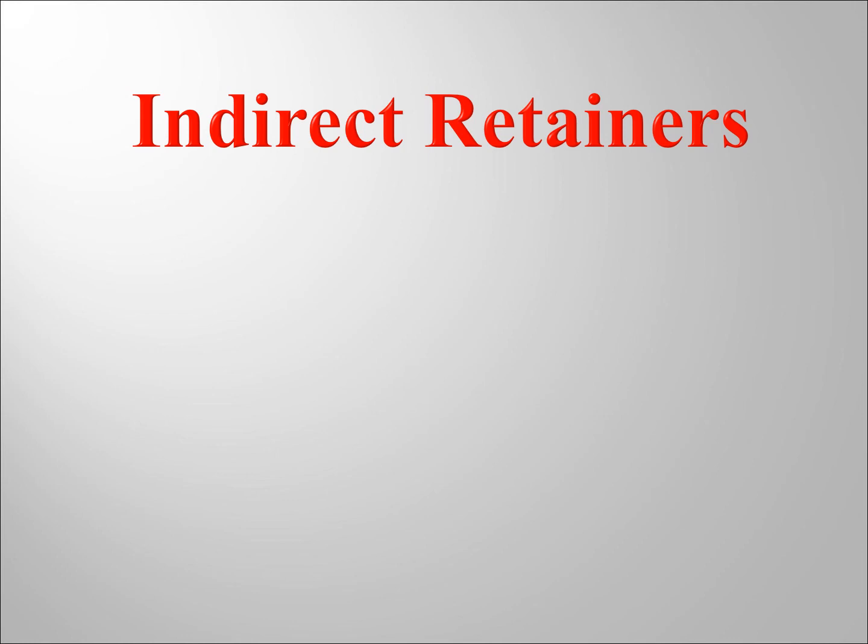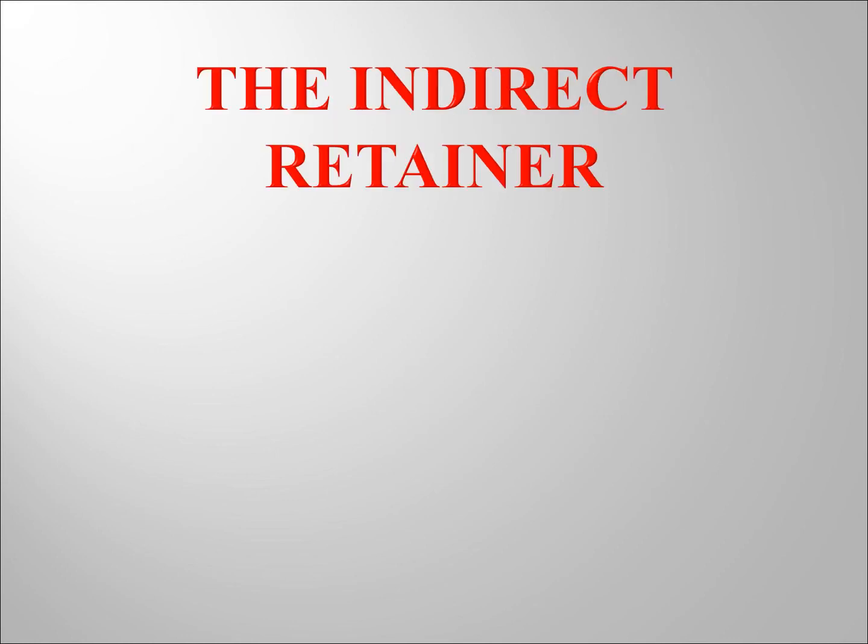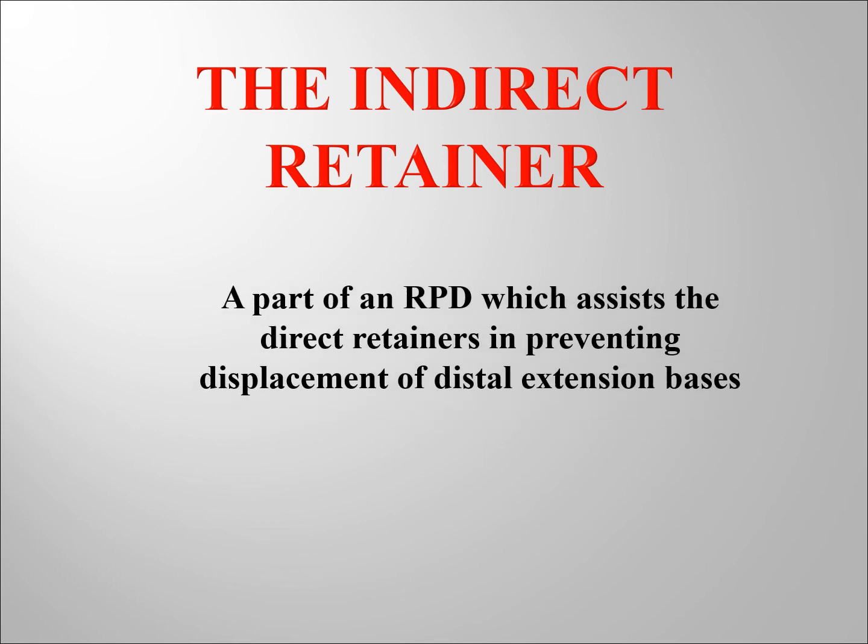Alright, now if you consider the other scenario, basically in class 1 and 2 prosthesis, or long class 4s, long saddle class 4, there is another possible kind of movement that you have to provide retention against, movement where you have dual support.